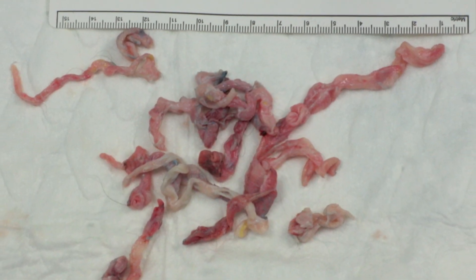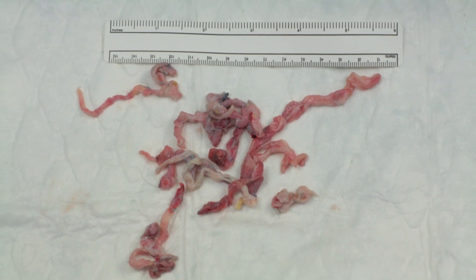Even very large varicose veins can be removed through a 1mm circular defect. So that's how I perform micro-phlebectomy using a 1mm dermal punch. I recommend it because it's quick, it produces a perfect 1mm circular defect every time without regard to the orientation of the skin, and it allows the easy extraction of even very large varicose veins without tearing. The elasticity of the skin accommodates the varicose vein, and once the vein has been removed, the elastic recoil of the skin leaves a very small defect, which gets even smaller once the local anaesthetic comes out of the area.